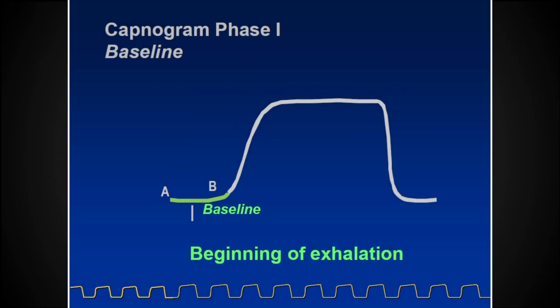Now we're going to move quickly through this, and don't overanalyze the plateaus or the points here. I think I do have one question on the test like, what would you see in a D point? I'm changing the language of that, right? So I don't expect you to in any way memorize where the A, the B, or each of these things are, but I will tell you what I do expect. This here and along the bottom are normal capnography, right?